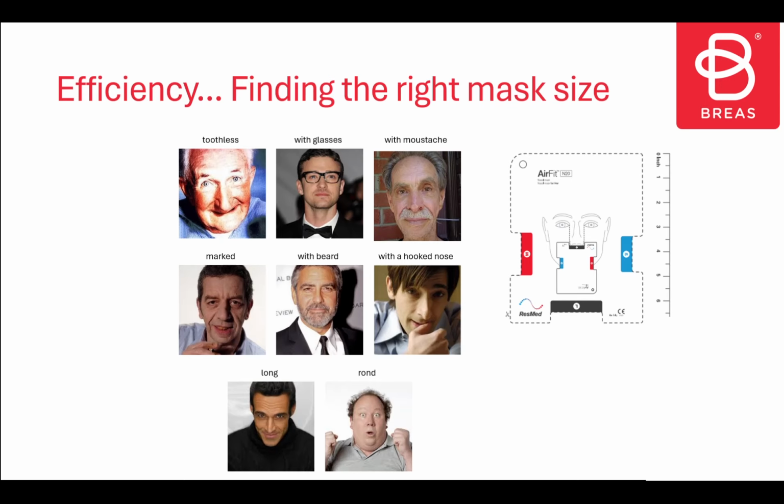To do this, there are several things that can be done. On the one hand, we can try guides that certain mask manufacturers offer us to measure the exact size. But also, and this is the most important thing, is to try with the patients. We will have to try different types of masks until we find the mask that gives us the best effectiveness and comfort.